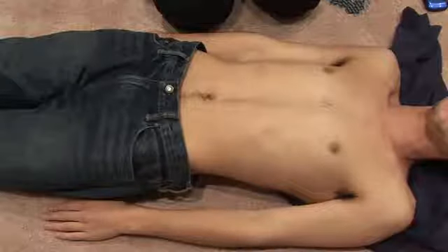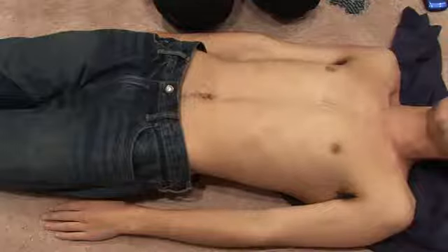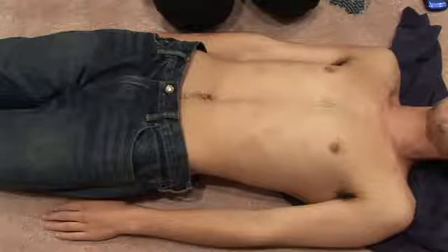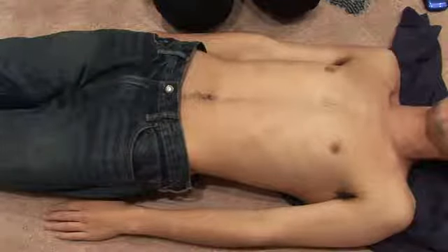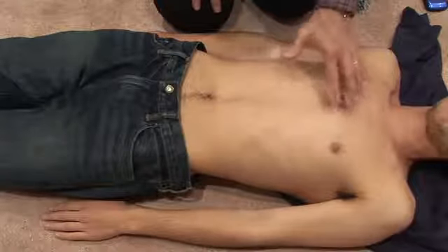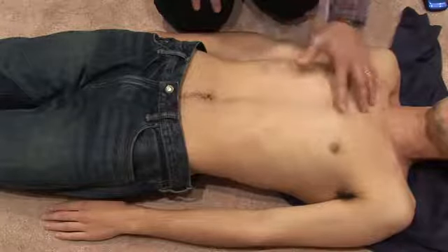Hey, this is Dr. Nick from the ECG Academy, and we're going to go over the anatomy of the chest because in order to put the ECG electrodes in the proper place, you have to be familiar with the anatomy. I've seen a lot of people put the ECG leads in the wrong place, the electrodes go in the wrong spot, and then it makes the ECG look abnormal when it isn't. So let's go over the anatomy of the chest.